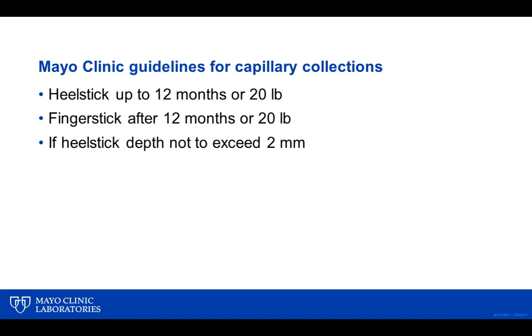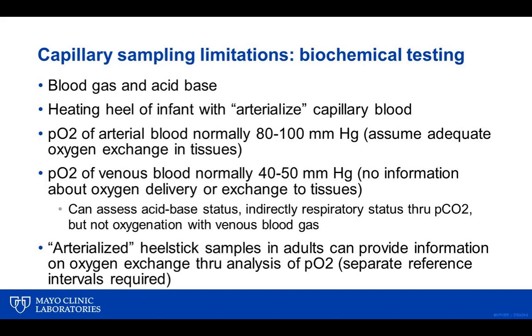It isn't done much in the U.S. because the devices are not approved for that purpose, but really talking about heel stick, finger stick, and earlobe as the major sites that have a rich enough capillary blood that you can get a consistent sample for capillary measurements. So we'll talk about the use case of capillary blood for infants and children.